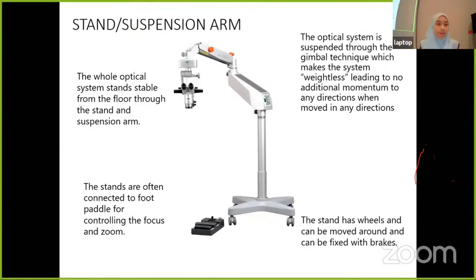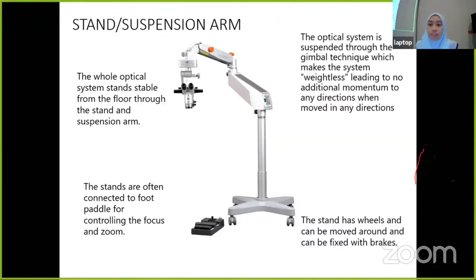Next is the third part of the microscope: the stand and the suspension arm. The whole optical system stands stable from the floor through the stand and the suspension arm. The optical system is suspended through the gimbal technique, which makes the system effectively weightless, resulting in no additional momentum in any direction when moved. The stand has wheels so it can be moved around and fixed with brakes, and it is also connected to the foot pedal for controlling the focus and zoom.